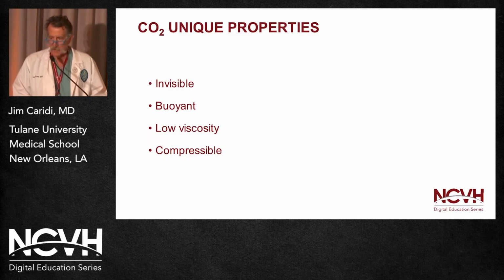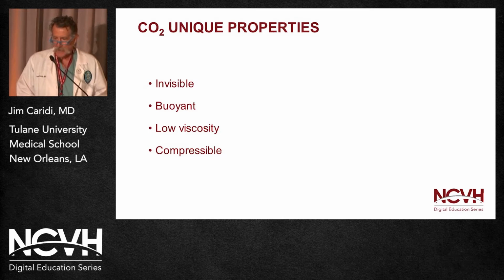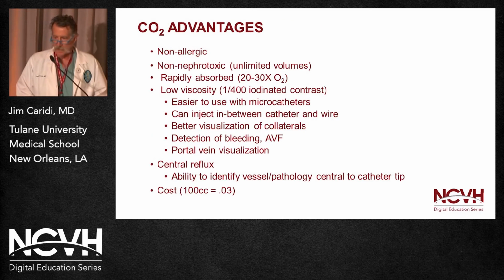So the gas has unique properties. It's invisible, it's buoyant, it's low viscosity, and it's compressible. And that affords us a ton of advantages over iodinated contrast. It's non-allergic, it's non-nephrotoxic, it's rapidly absorbed.